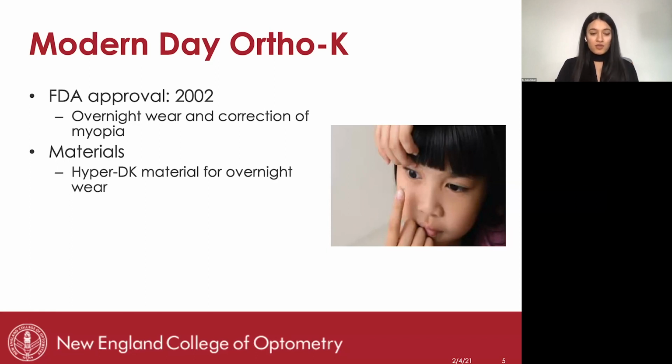So I want to make a point here to highlight that yes, Ortho-K has been approved for the treatment of myopia, but that's not the same thing as myopia management or myopia control. So the FDA hasn't granted approval for myopia control. So when we deal with our patients in the myopia control clinic, we are educating them on this in great detail.